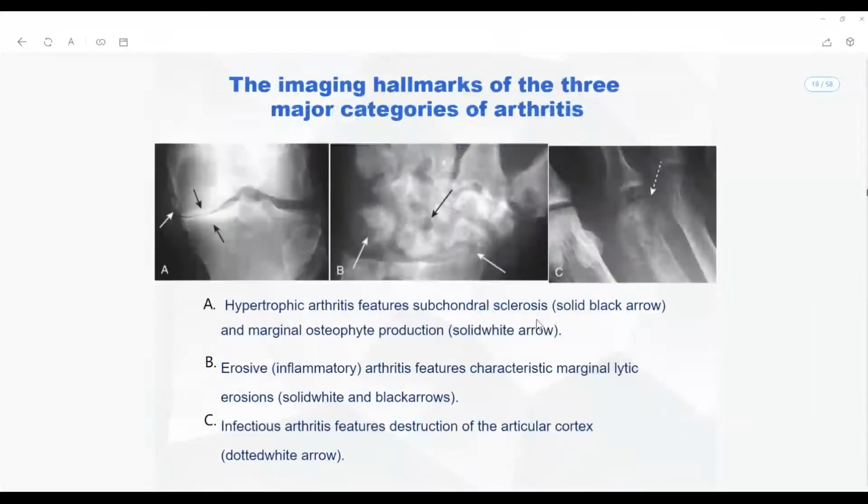That's it. So right now we are going to look at the three given conditions. You see here, the first one, I'm looking at the left knee joint along the medial surface of the tibia, okay, the articular surface of the tibia. I can see that there is a gross, significant reduction in the joint space that is present between the medial meniscus, right?